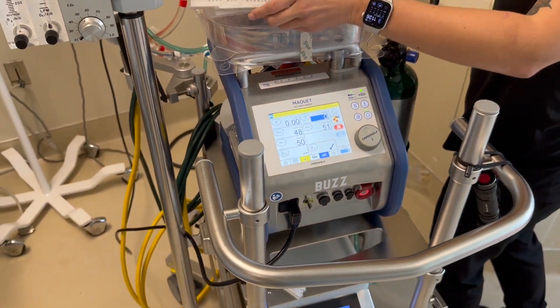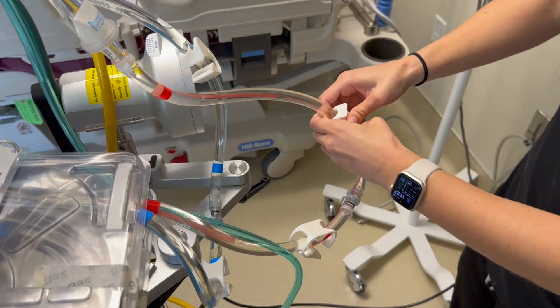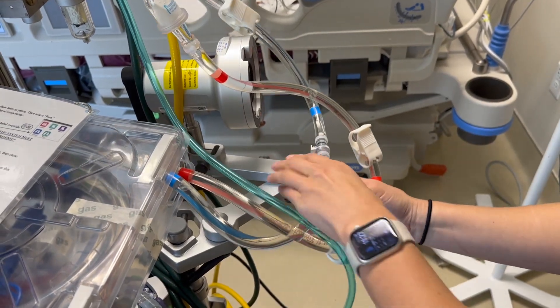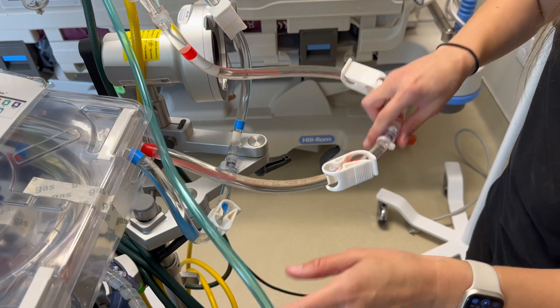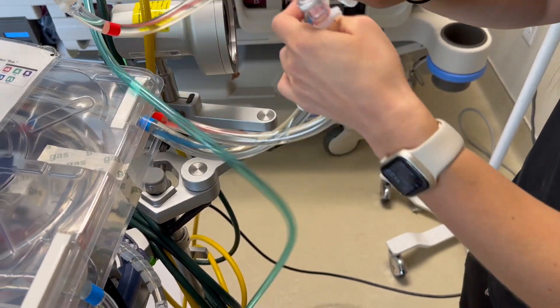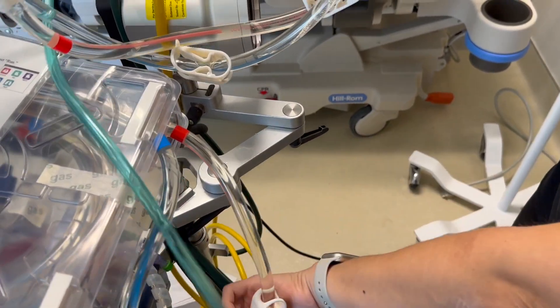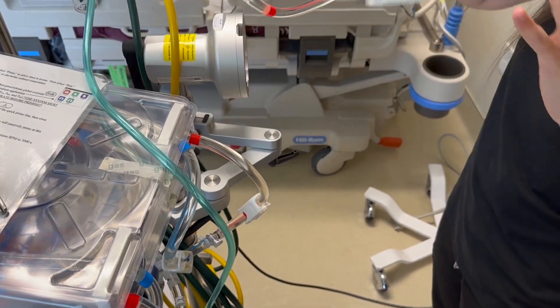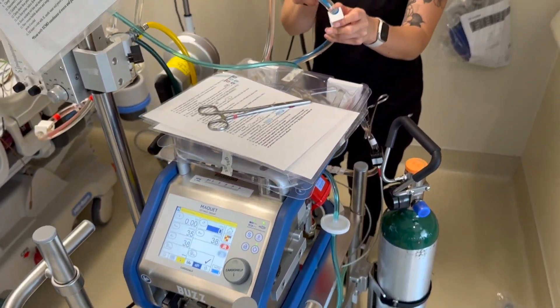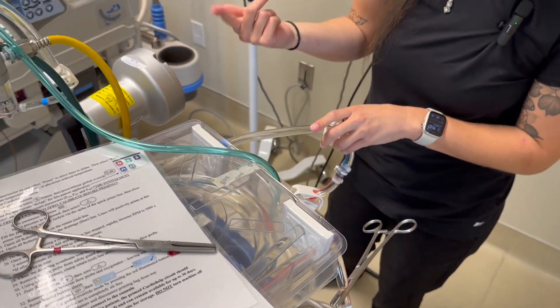Now take off your prime bag. Clamp your reds and your blues, then put your red to red and your blue to blue, keeping it as sterile and clean as possible — put on gloves if you can. Now your prime bag is disconnected and you can throw it away. You're ready to go to OR. Do not unclamp the line ends, as there is air inside — if you unclamp, you will get air in your circuit. The surgeon will cut them off when you're back in OR.